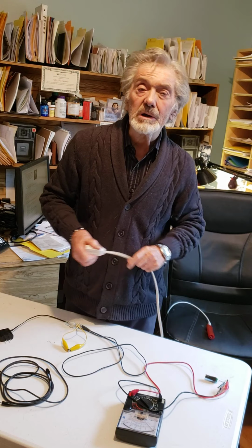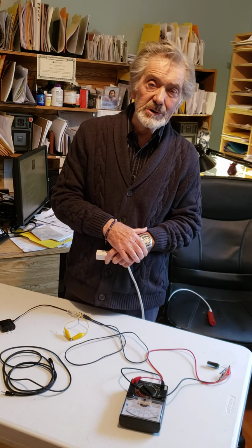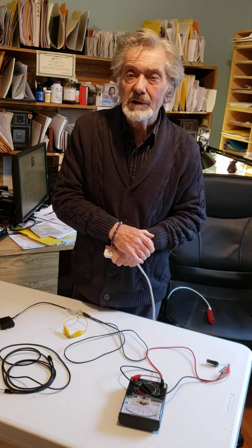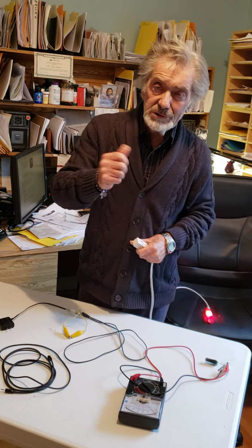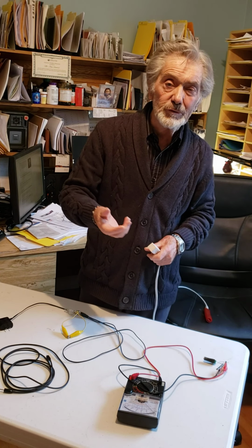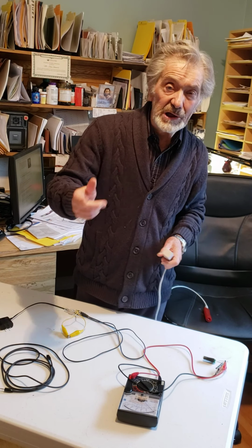I want to tell you a bit about some problems that we have with any instrument, particularly in clinics. It's that of breaking cords. Cords tend to break with use, particularly with continual flexing. No metal can stand that, even the strongest. It eventually breaks. So after a few hundred or thousand times in your clinic, different cables will break.